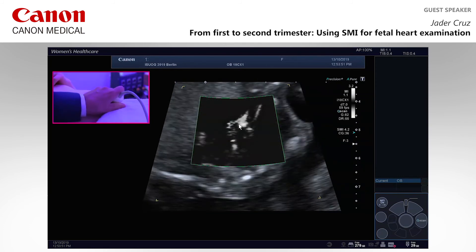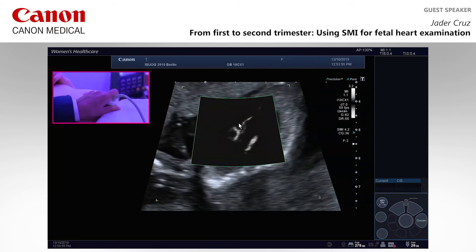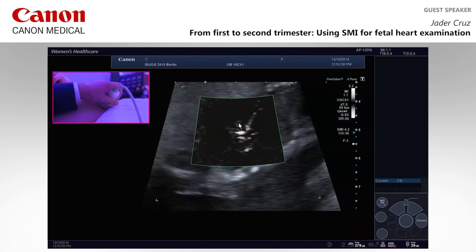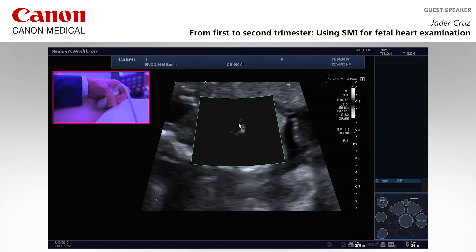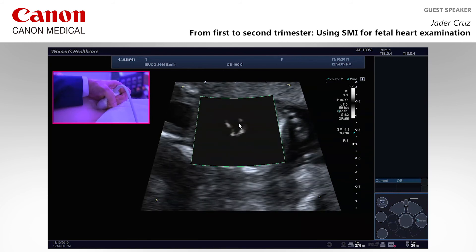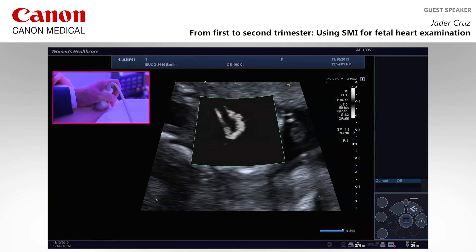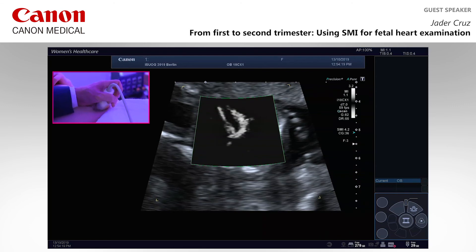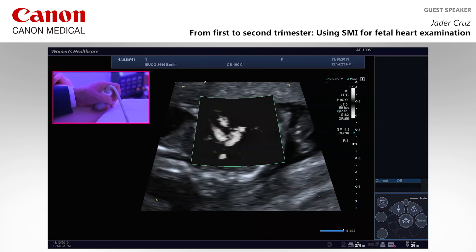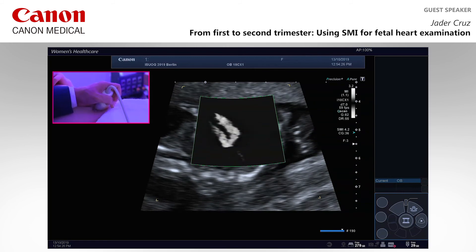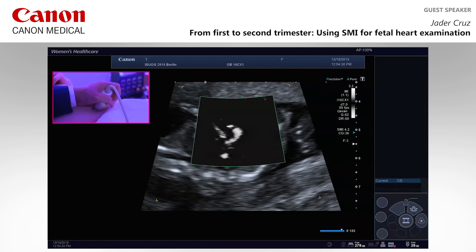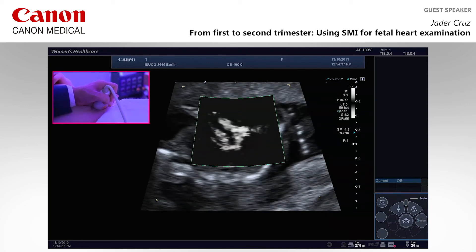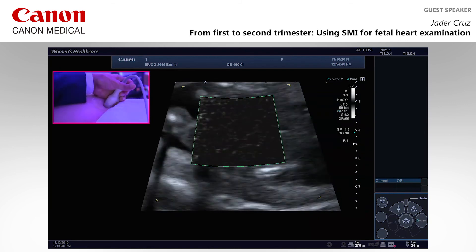What I wanted to show today is the clear visualization of the interventricular septum in a single pass — four-chamber view and you can directly see the interventricular septum without any communication. CineLoop works very well here because of the noise and presets we're still working on; it lets you go back slowly and review everything. Interestingly, you can see when the valves are closed very clearly, and you can even see the offsets of the two AV valves easily and clearly.